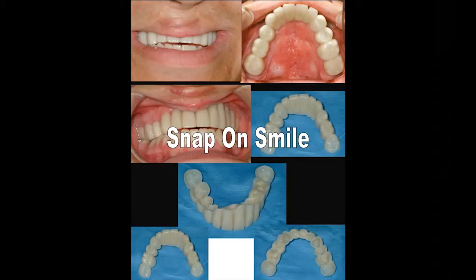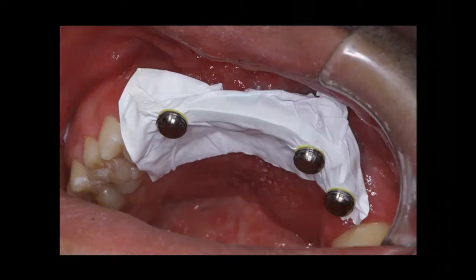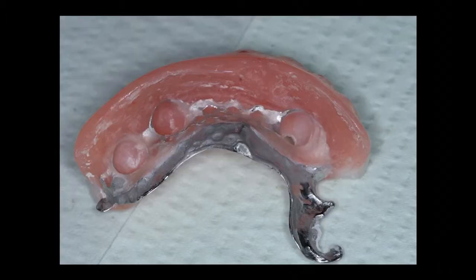And that worked out well for a while. It wasn't real aesthetic. It kind of looks like a denture. He was so happy to have something, after running around for so long with nothing at all. So we decided to upgrade. We put these rescue implants in. Here are the locator housings. We put the Teflon tape down over the locator attachments before snapping these into place. Here's the prosthesis that the lab made, metal reinforced. Made sure there's adequate relief in all these areas using Fit Check.